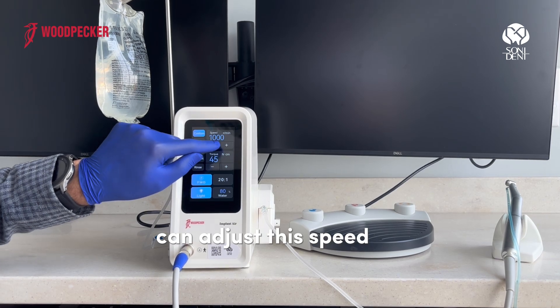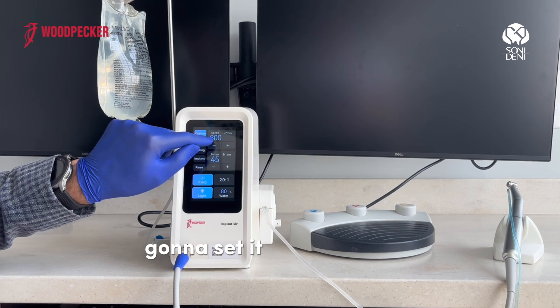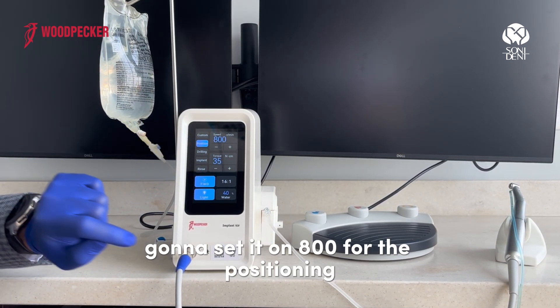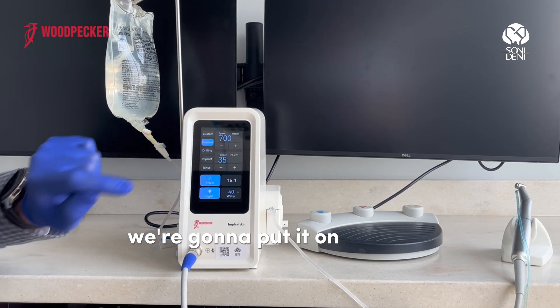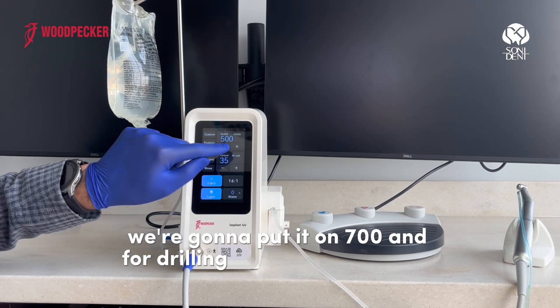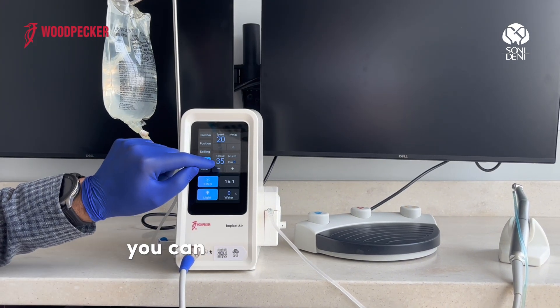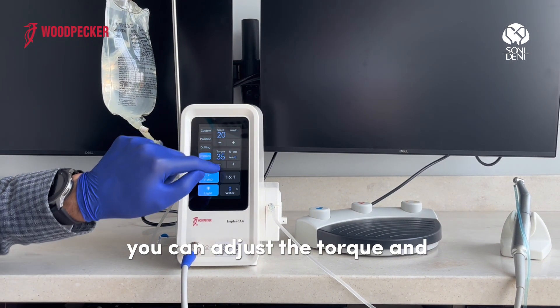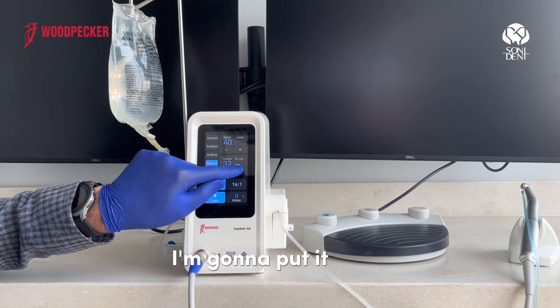You can adjust the speed by pressing the plus and minus buttons. I'm going to set it on 800. For positioning, we're going to put it on 700, and for drilling, 600. For the implant program, you can adjust the torque and the speed. I'm going to put the torque on 35.